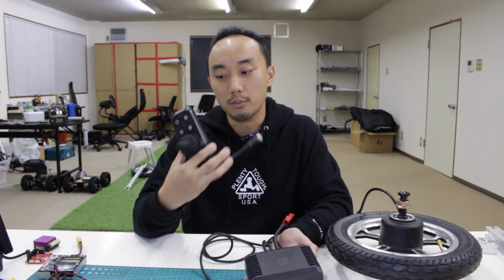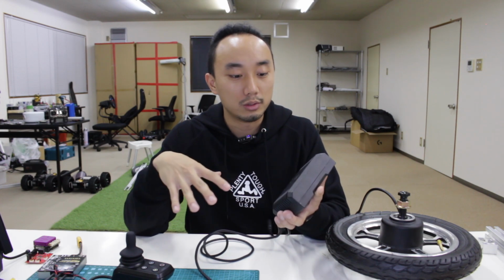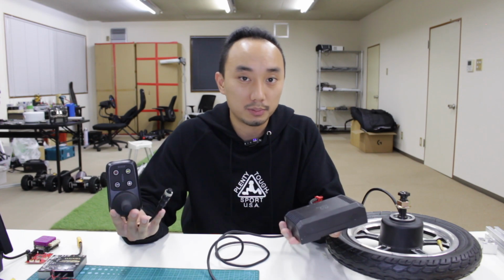And in our case, we want to use it as a robot, so we don't need this joystick anymore. But we need to know how to control this ESC with another controller, like an Arduino or something else. I have the code and the documentation about how I hacked this one in my GitHub repo, so let's check it out.